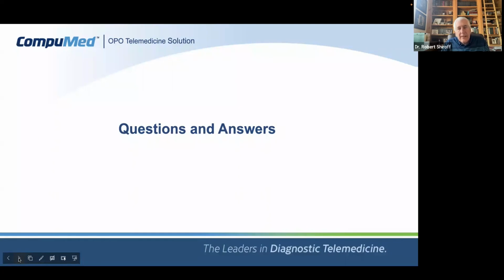Yes, there is. CT angiography is available. It is with a 64 slice CT machine. One can get pictures of the coronary arteries. They are not quite as good as, or accepted at this point in time in the literature. It's coming around. It requires special skill to interpret them and special training.